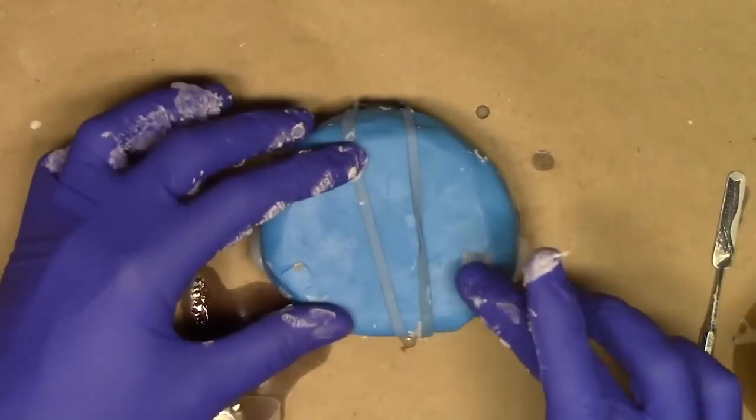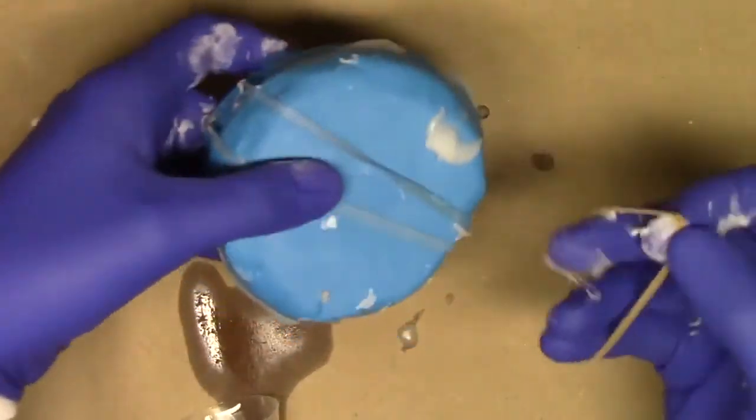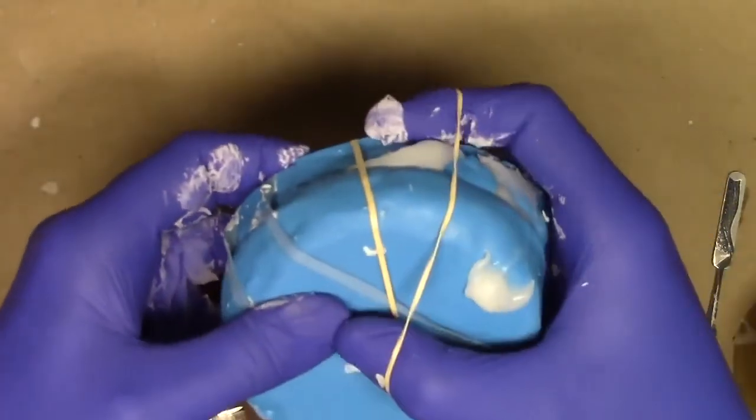And we're at this point. I'm going to fill that monomer like that. And I like to put on a second rubber band just for good measure.